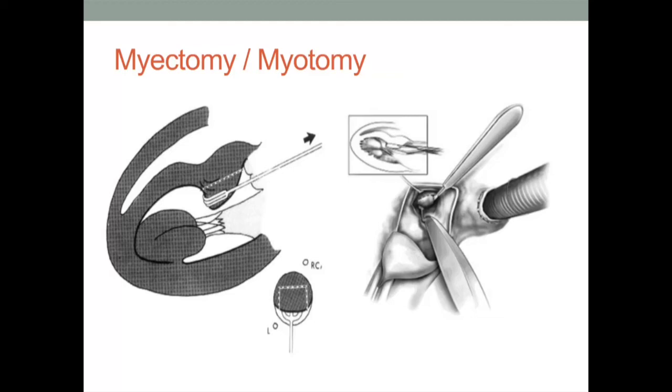A deep wedge of septum is now resected beginning at the base of the septum and working toward the mid-ventricle. By carefully understanding preoperative TTE or TEE measurements, care can be taken to leave at least 1 centimeter of retained septum and to avoid iatrogenic creation of a ventricular septal defect.